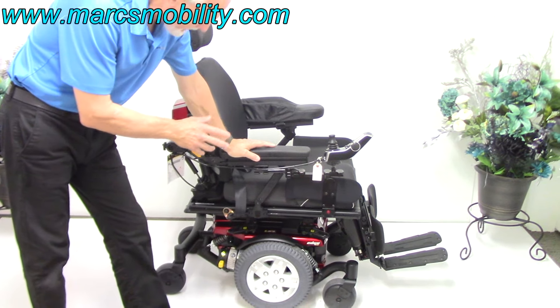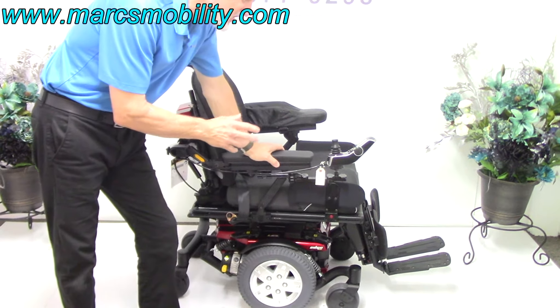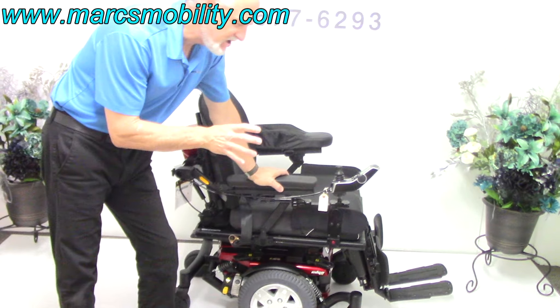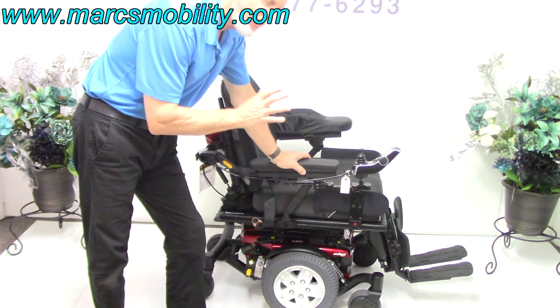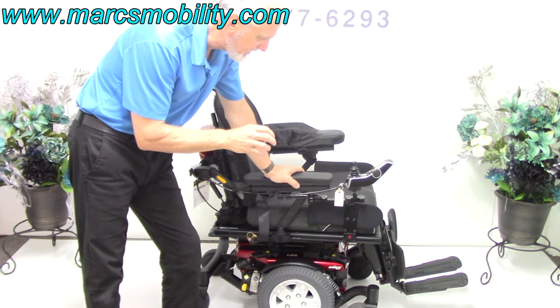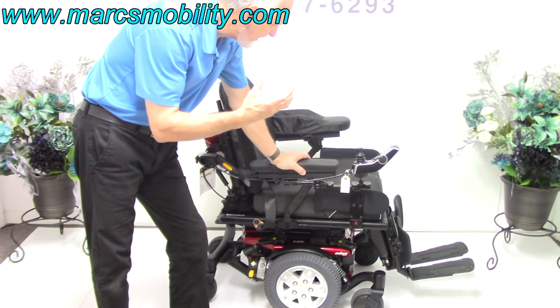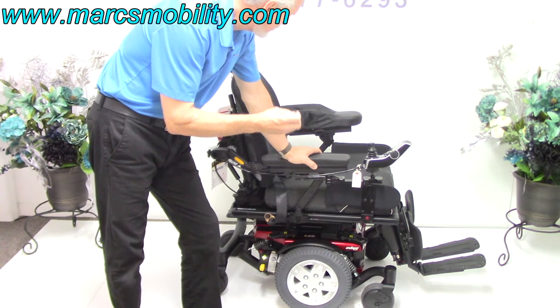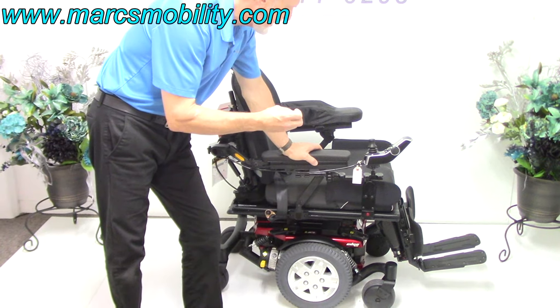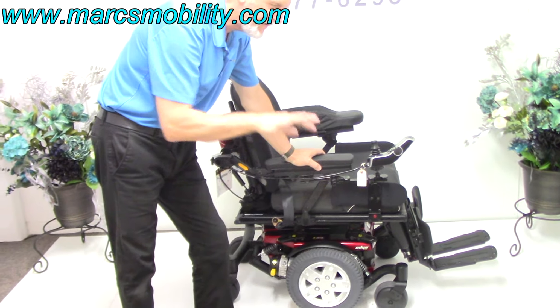This is the Quantum Q6 Edge 2.0 HD — the heavy-duty model of all the Quantum Edges. It has a 450-pound weight capability. The motors are heavier, everything is geared slower and heavier, and the frame is bigger. It has electric tilt, electric recline, and electric legs — but no seat lift.